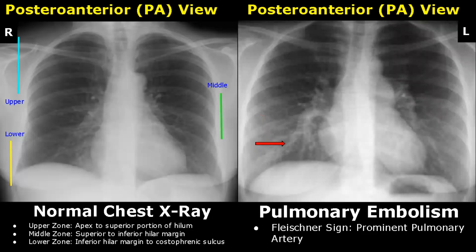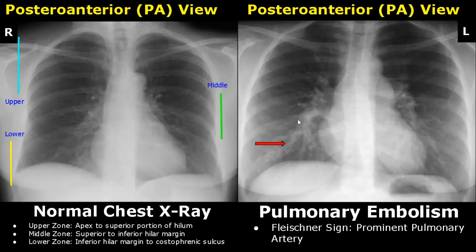Pulmonary embolism is a term given to occlusion of pulmonary arteries caused by a thrombus. It has a series of signs which can be observed on x-ray. The first is the Fleischner sign, in which the pulmonary artery becomes prominent. You can see the difference in the density of the pulmonary artery — it is brighter than usual.